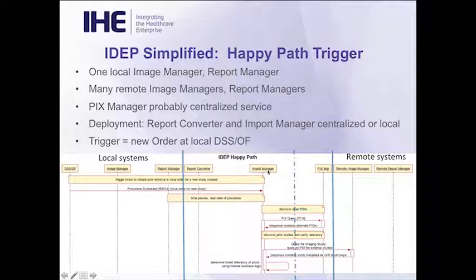All right, so to jump into the sequence diagrams themselves. These yellow bars, with text across the top, the intent of those is to tell you what's coming next and why we're doing a transaction.